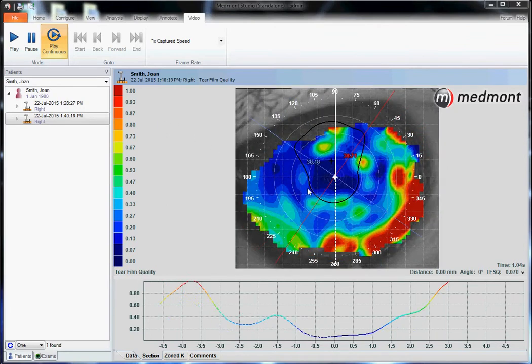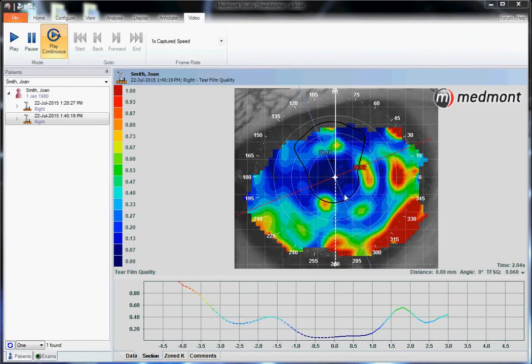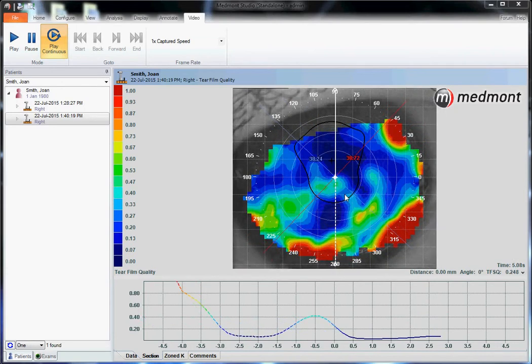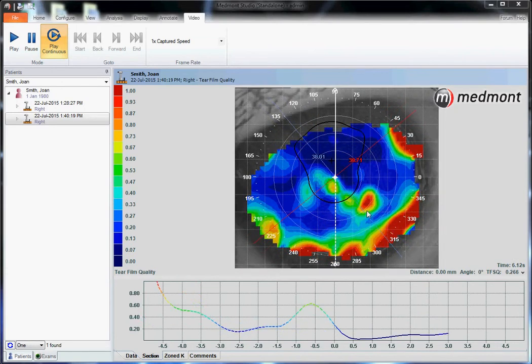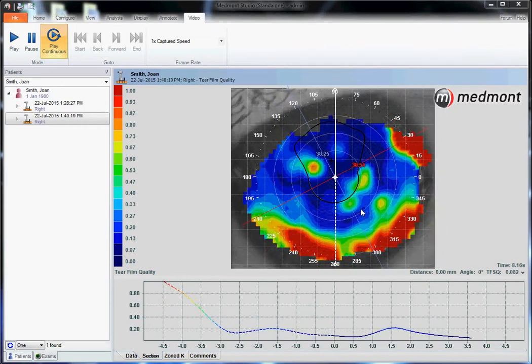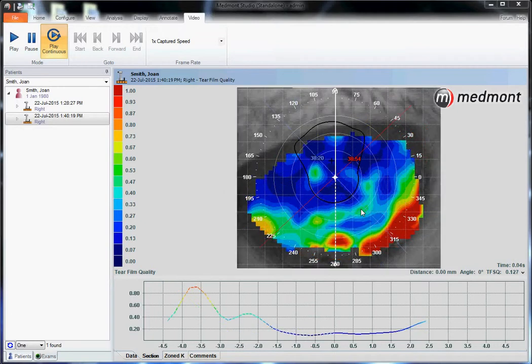Where you see dark blue, that's where the tear film is smooth and even. Where you see hot areas, that's where the tear film is breaking up.